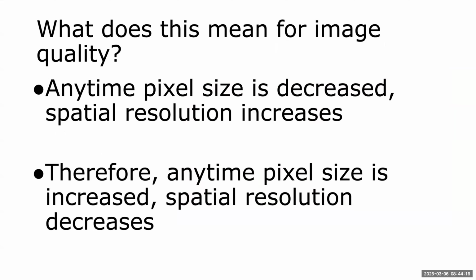So what does this mean for image quality? Again, anytime the pixel size is decreased, spatial resolution is going to increase. And then anytime pixel size is increased, spatial resolution is going to decrease. So think about if you can see pixels in your image. I don't know if it's a real thing or not, but we can refer to that as the image being pixelated, then your spatial resolution is going to be worse.